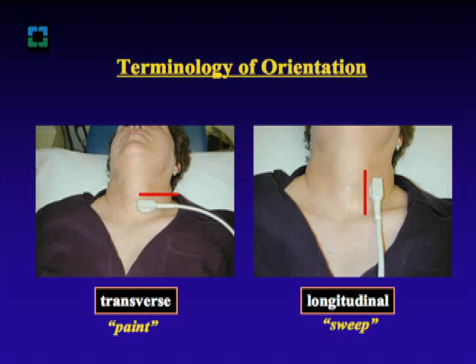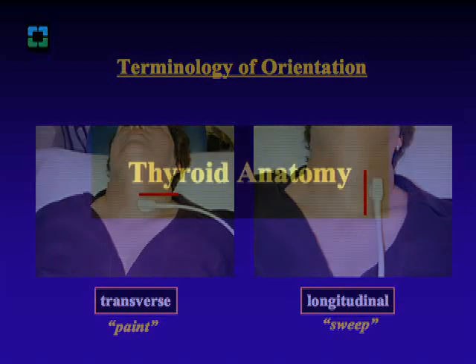Each orientation provides for a unique view and thorough assessment of neighboring structures. As demonstrated, a painting motion up and down is best for the transverse views, while a sweeping motion that rocks the probe left and right facilitates longitudinal views.